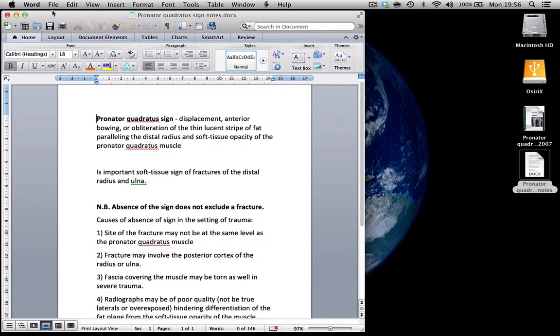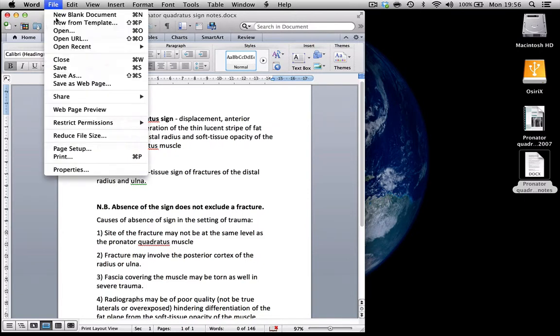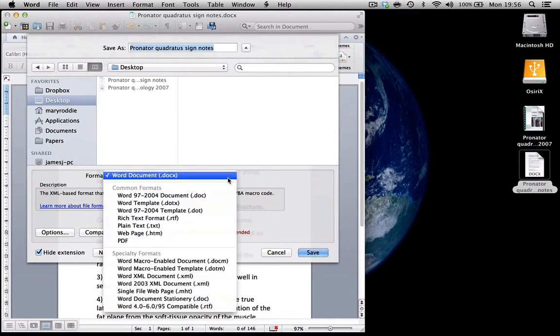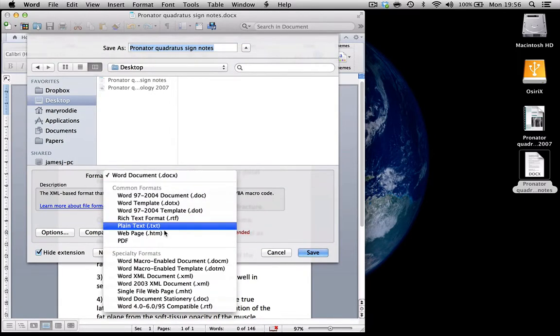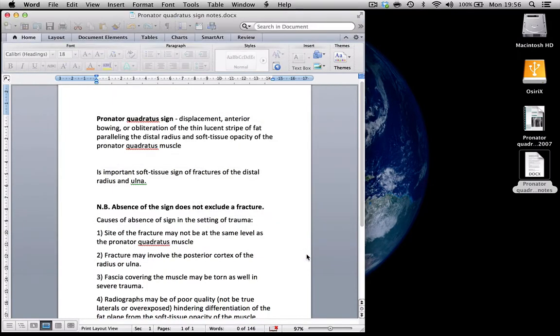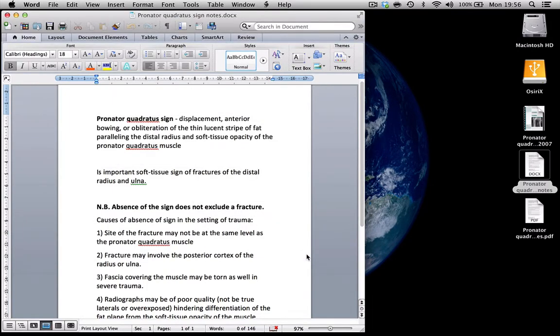All I need to do is to save this as a PDF document. So there it is and I'm going to save it onto the desktop and there it is. It's appeared as a PDF document.